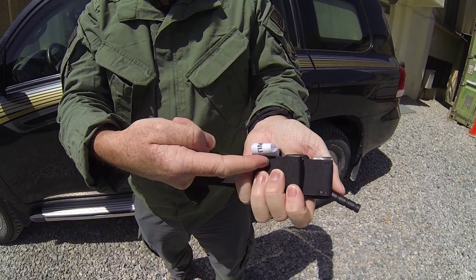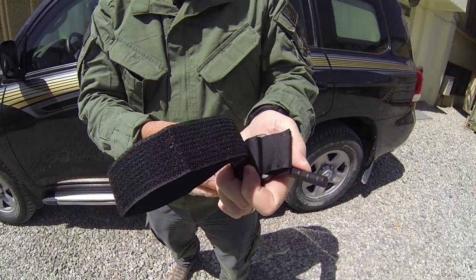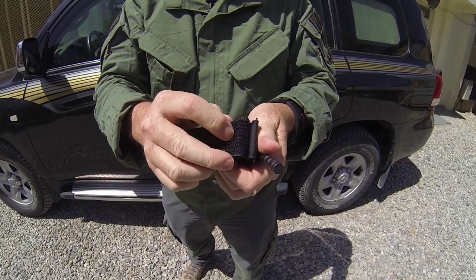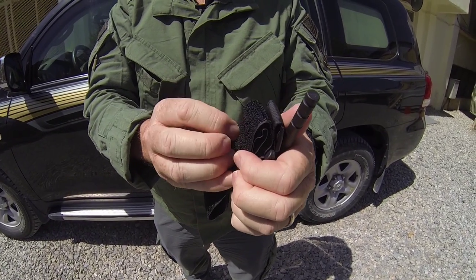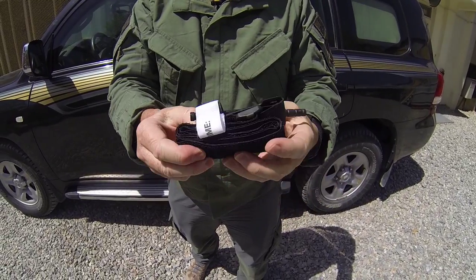At 4.5 inches, you're going to commence your first fold. You're going to continue the fold so it goes all the way up to where the self-adhering band is now flush with the top of your plastic backing plate. Then you're going to naturally make the last turn.